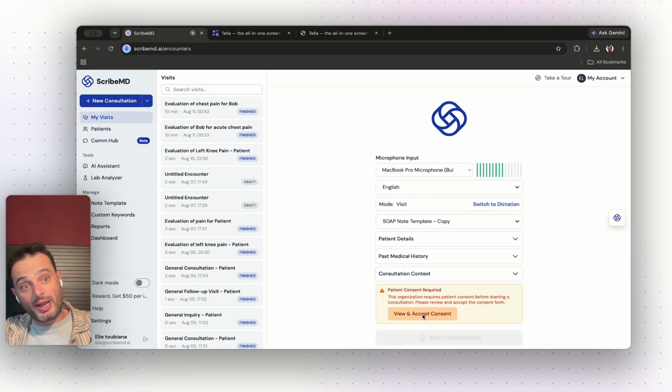the conversation so that I don't have to look at my computer while I'm talking to you. Otherwise, I'm going to be typing away. So I'd rather just focus on you. So is that okay if I record for my own note taking? And most of the time, patients will say yes.